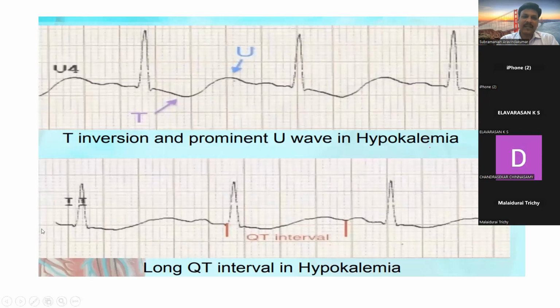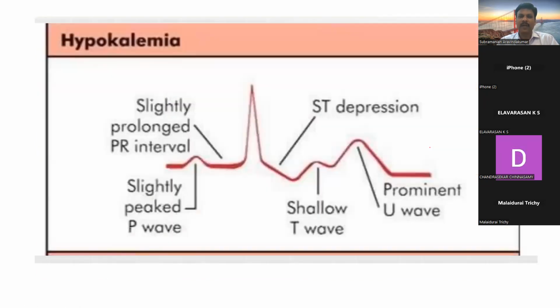See here, typically P wave is present, QRS complex not very wide, and you see ST depression, and you have a positive U wave. See here, the QTc is prolonged. Roughly, you can see more than 60-70% of the RR interval, which means it is very much prolonged. U wave is present. So QT interval is prolonged, U wave is prominent, and you have ST depression, typical of hypokalemia.